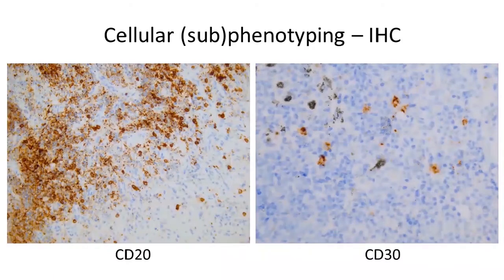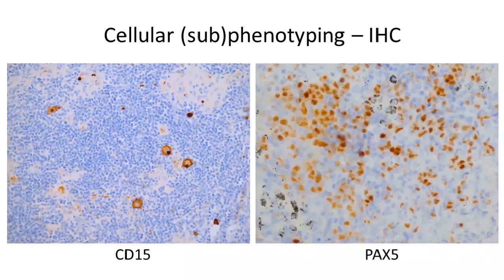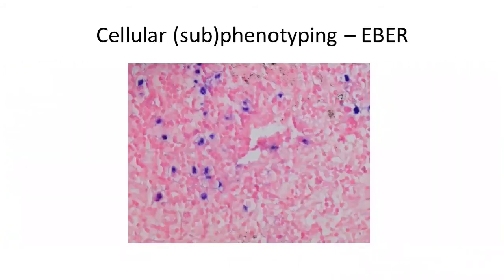That showed the following picture in the H&E stain, where we can see that there's an extensive infiltrate of small lymphocytes, and there's quite a lot of sclerosis. There's the odd eosinophil, and if you see this sort of picture, particularly if there are some larger cells in this infiltrate, you might suggest that this could potentially be a Hodgkin lymphoma, but of course that needs to be confirmed. Then a CD20 stain was done, showing an infiltrate of B lymphocytes and perhaps a few larger cells.